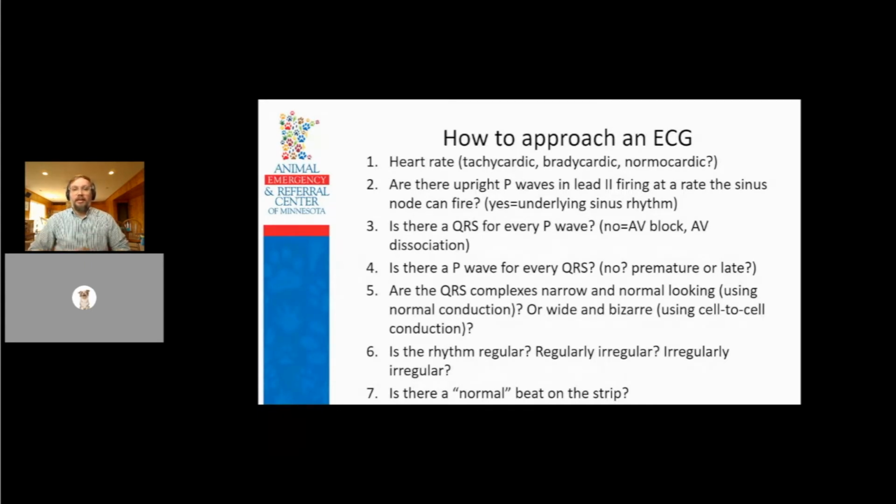Heart rate is, I think, the most important thing and often the most overlooked thing. Because really the question is, is this hemodynamically significant or electrically significant? And to answer hemodynamics is, what's the heart rate? If you have an arrhythmia but the overall heart rate is normal, it's probably not causing clinical signs, but if the heart rate's really fast or really slow, it might be. And it's a good place to start, because depending what's happening on the EKG, the rate that it's happening at may dictate whether to treat or not.